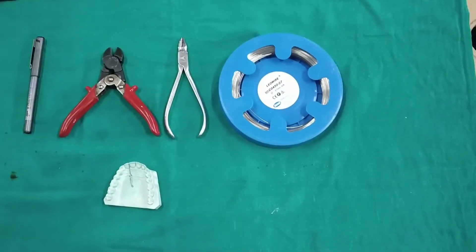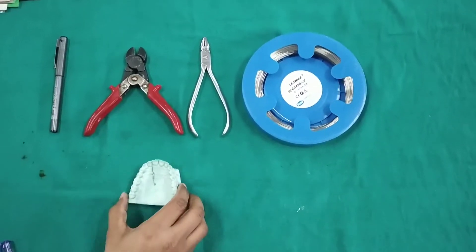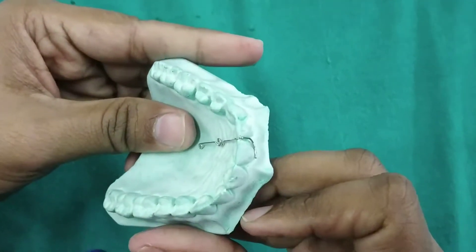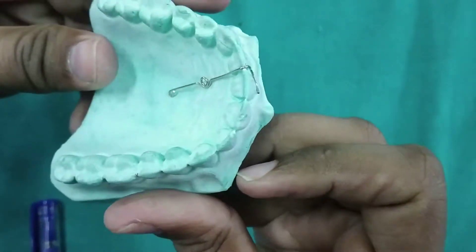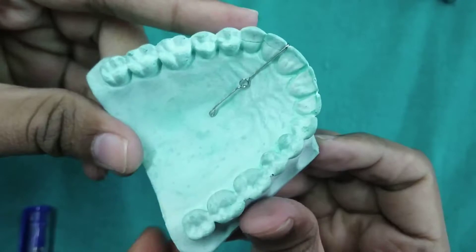Good morning everyone. In this video, we are going to fabricate a finger spring. Finger spring is also called as a single cantilever spring. It is used for the mesiodistal movement of the teeth. For example, closure of the midline diastema.